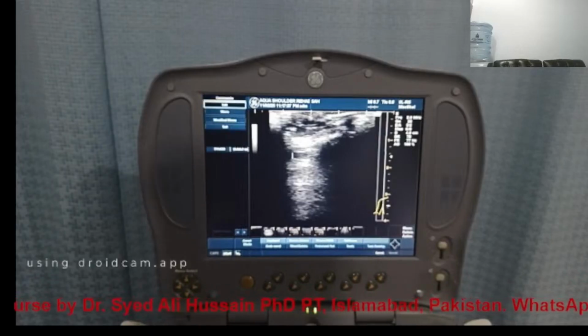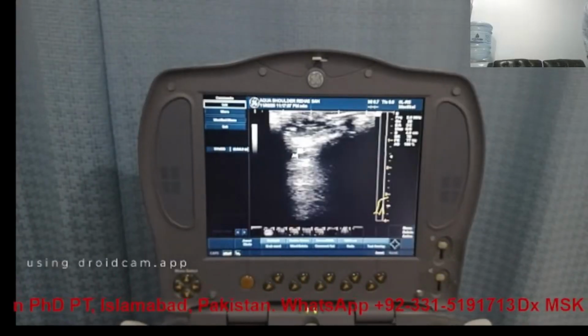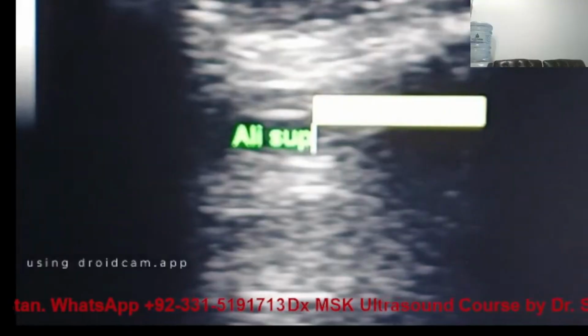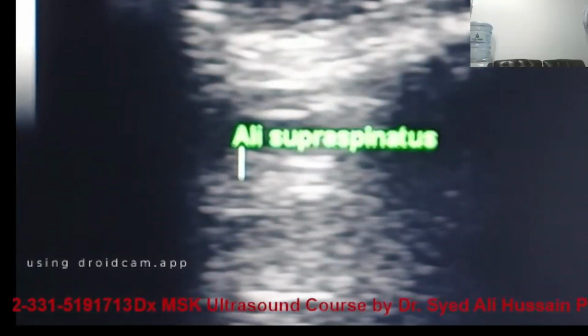If we click and, let's say, write my name, it's creating my name. I believe you can see this. So it's adding a comment. Let's say Ali supraspinatus. So now you can see, this is just to make comments.